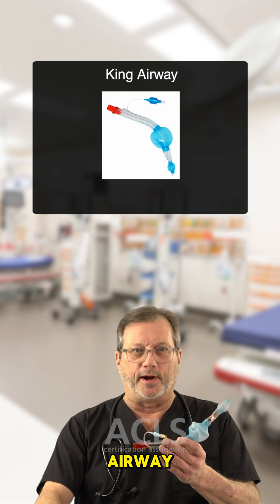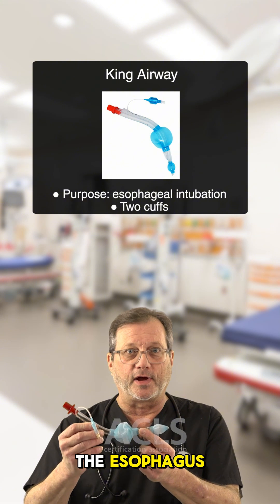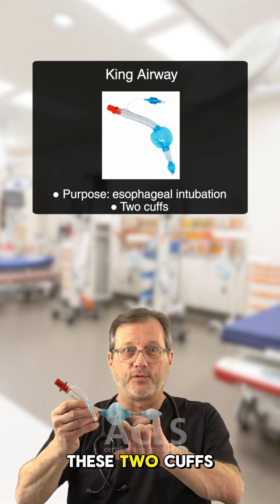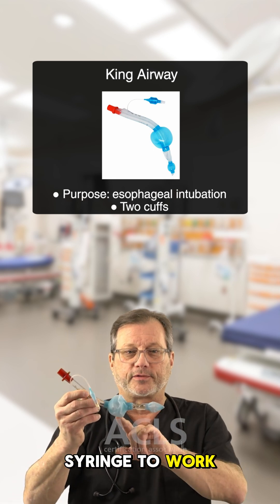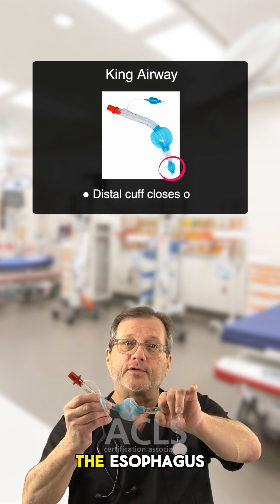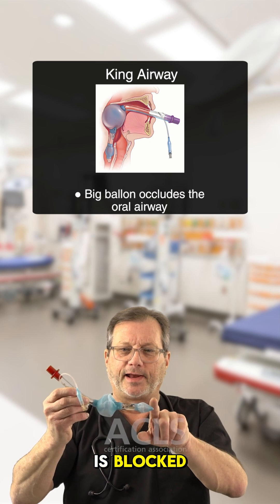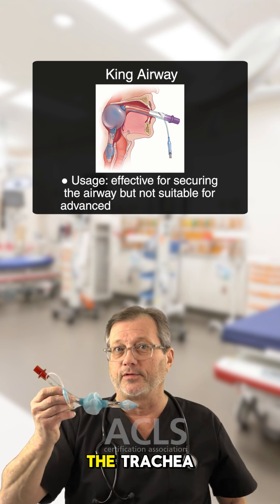Starting with the King Airway. This is designed specifically to intubate the esophagus. We are putting the tube into the esophagus — we are intubating the esophagus — and then we're going to fill up these two cuffs here with a large syringe. It fills the distal cuff and closes off the esophagus. This big balloon here occludes the oral airway, and because the esophagus is blocked and the way out is blocked in the oral airway, the air comes down through these fenestrations and right into the trachea.